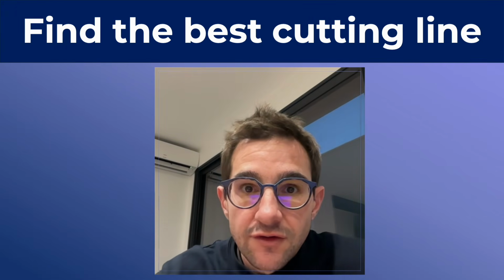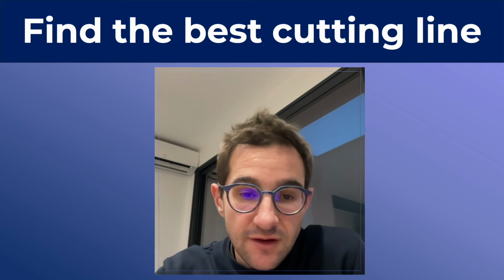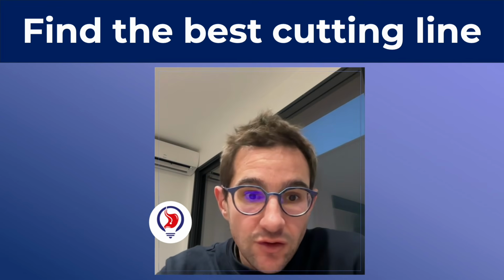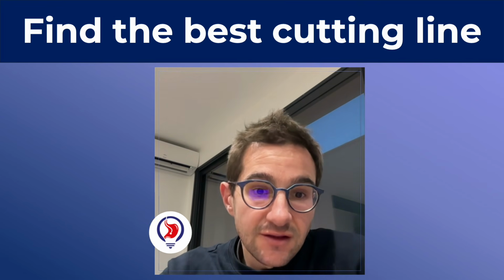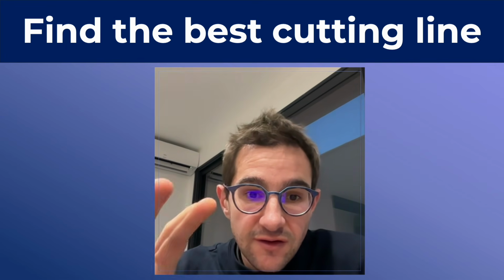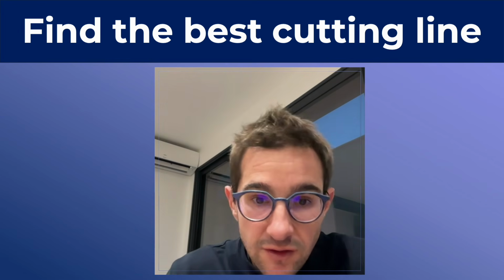So for this new episode, we will really enter into the dissection phase. I mean the part when you are under the mucosa and you want to dissect all the submucosal fibers that maintain the lesion on the muscular layer. And we will just discuss for this episode the best cut line during the dissection phase.